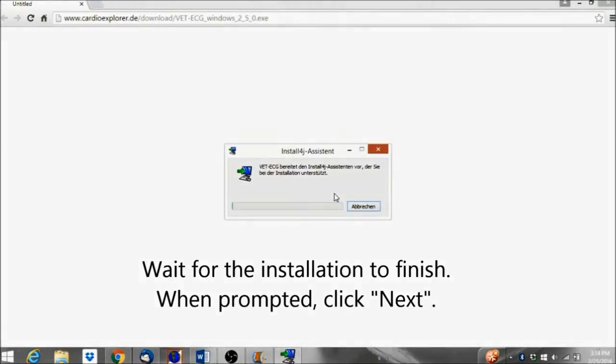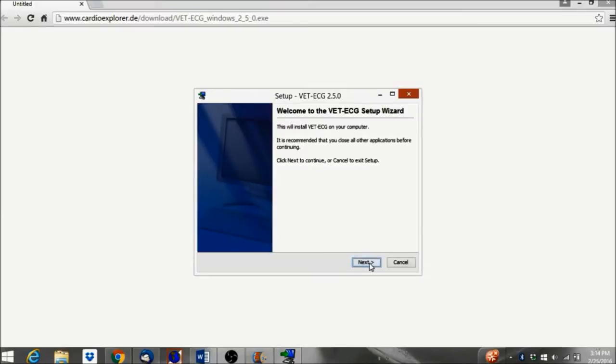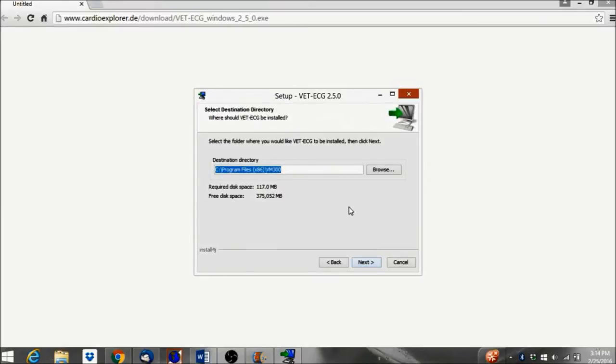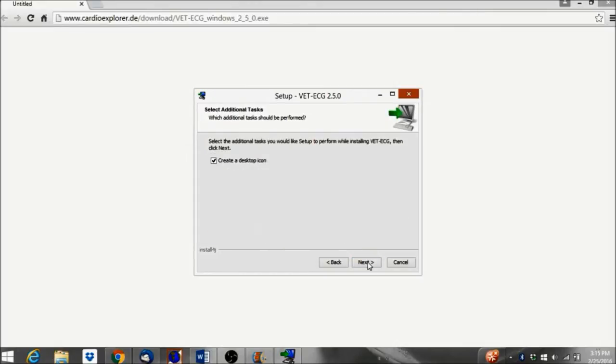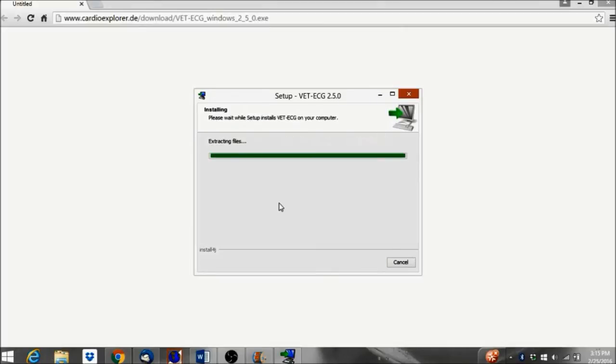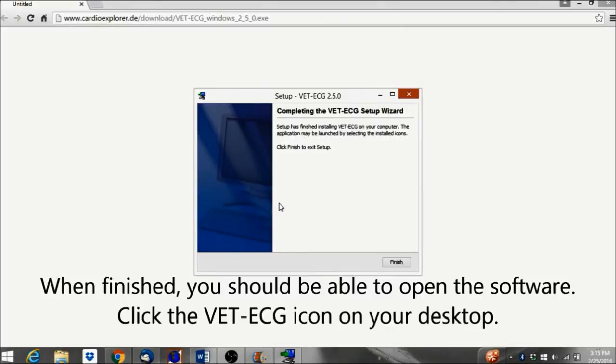Wait for the installation to finish. When prompted, click Next. When finished, you should be able to open the software. Click the VET ECG icon on your desktop.